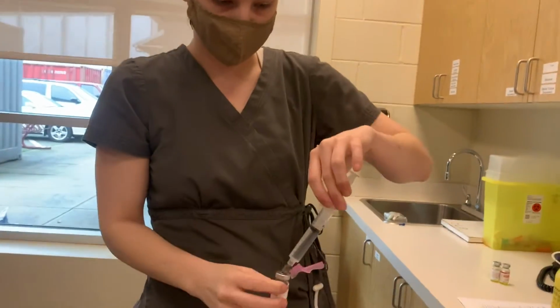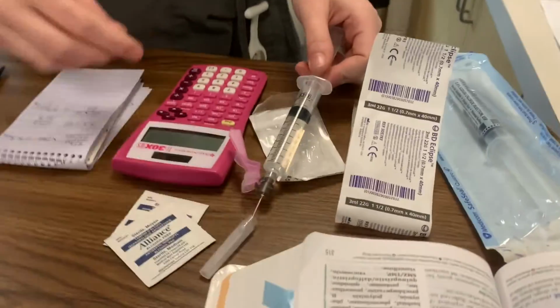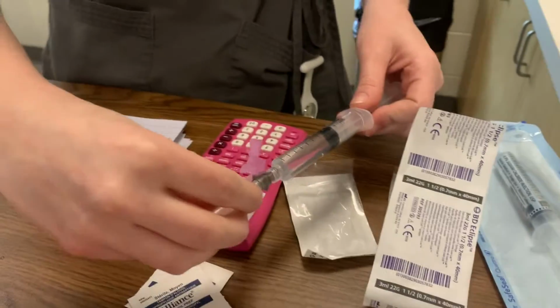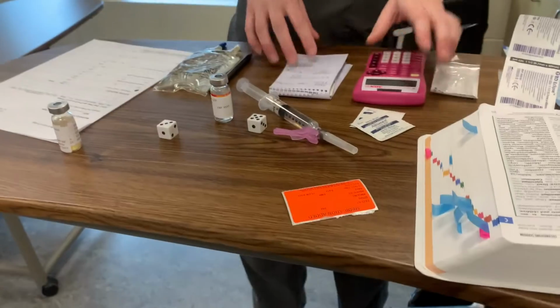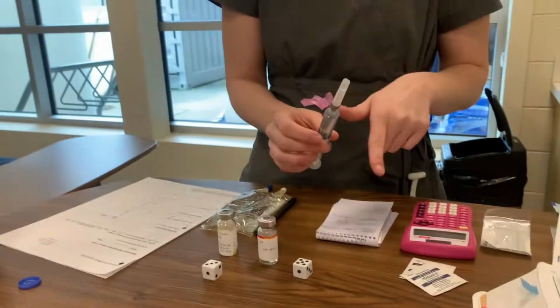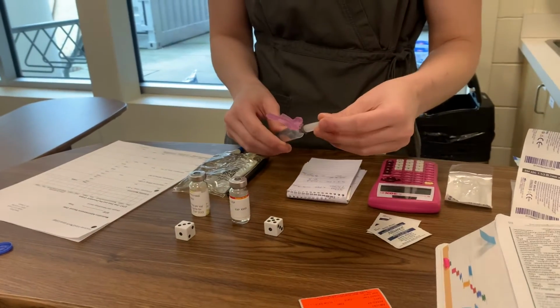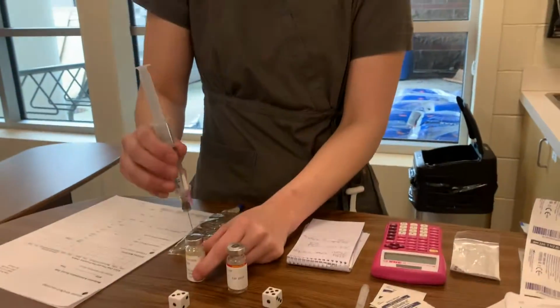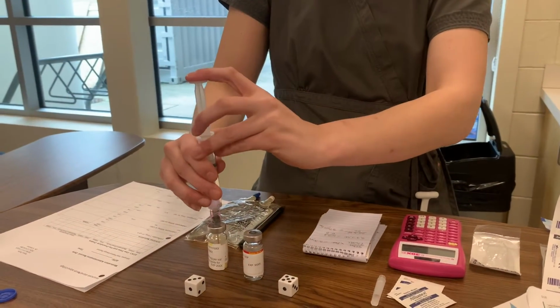Perfect. So now I have my 8 milliliters of water in there. Wonderful. I'm going to put that down, and then I am going to reconstitute it. So I'm going to be adding this 8 milliliters of water back into this bottle of my cefuroxime. And keep in mind, these are both already cleaned and dried.